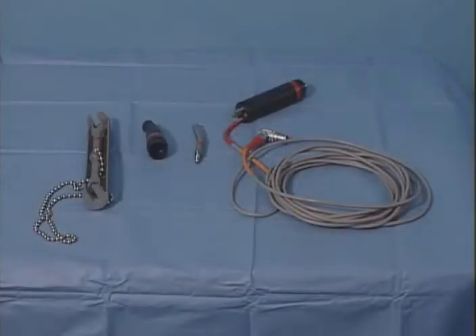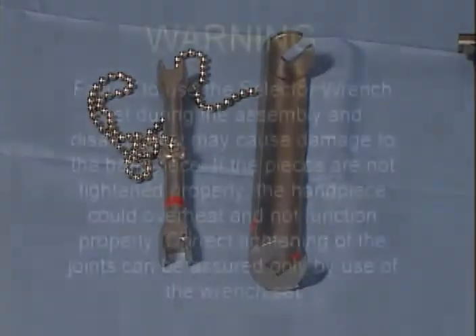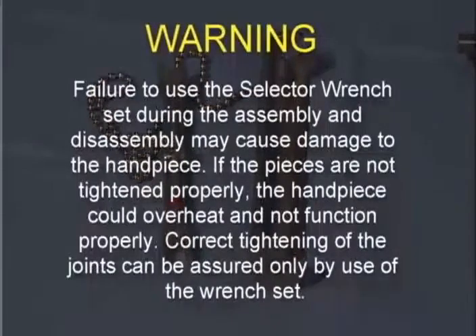Assemble the SELECTOR handpiece in the sterile field using the SELECTOR wrench set. Warning: failure to use the SELECTOR wrench set during the assembly and disassembly may cause damage to the handpiece. If the pieces are not tightened properly, the handpiece could overheat and not function properly. Correct tightening of the joints can be assured only by use of the wrench set.